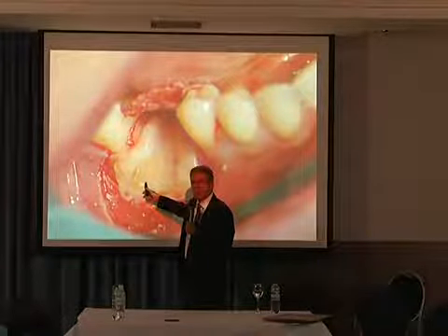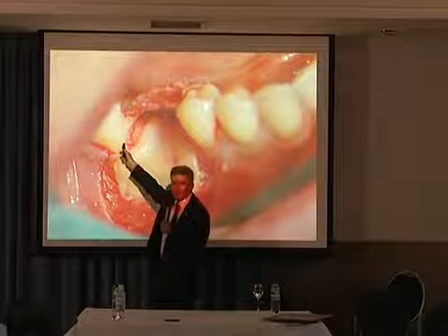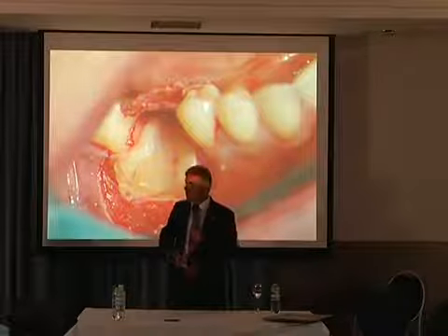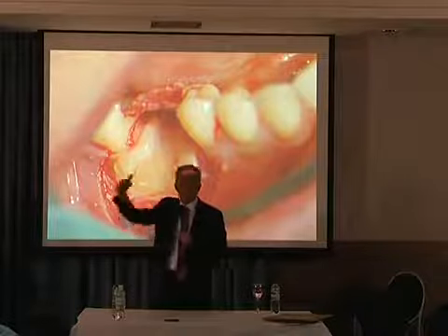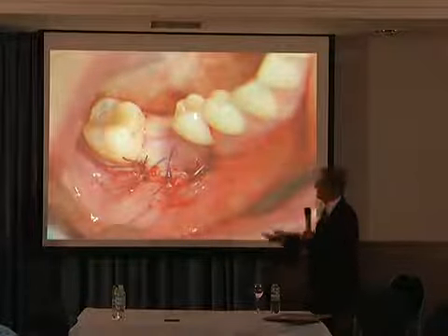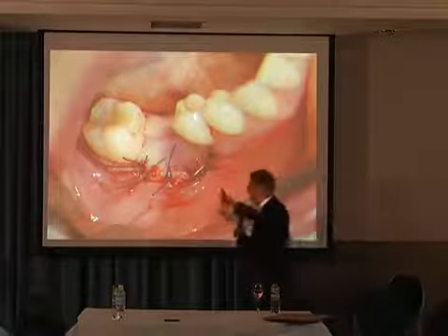If this is a resorbable collagen membrane, contact good or not good? No. Because of periodontal infection. Stitches. Two layers.